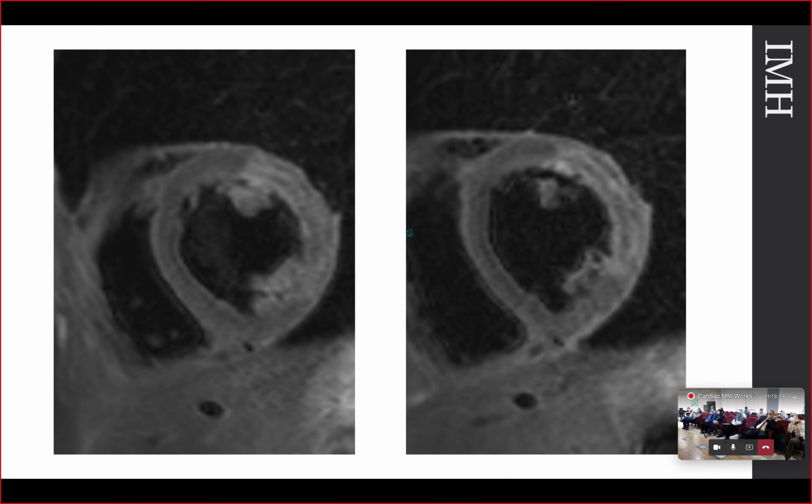Using the STIR, as you may see here, there is a large area of edema, there is a large area at risk, and the central core shows some areas of hypointensity. I'm not sure, it's just a thin line in the middle of the area of the edema.